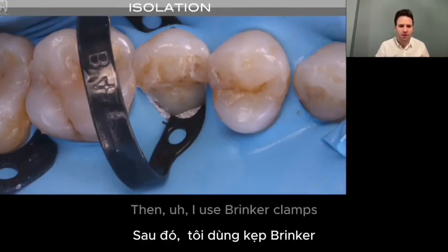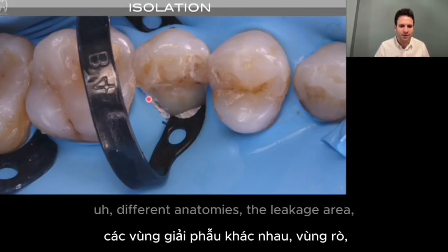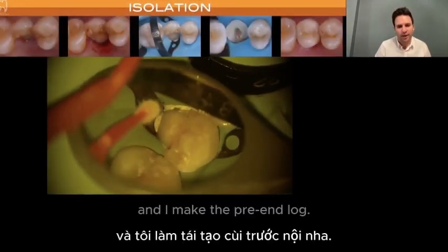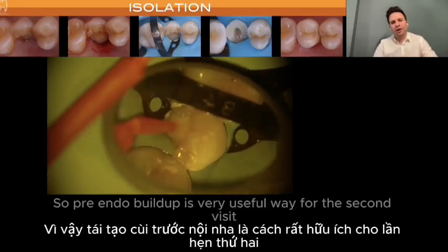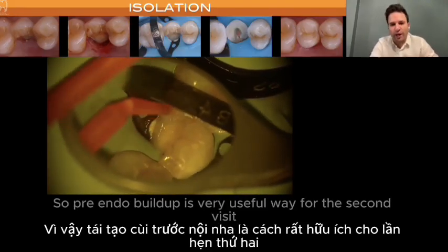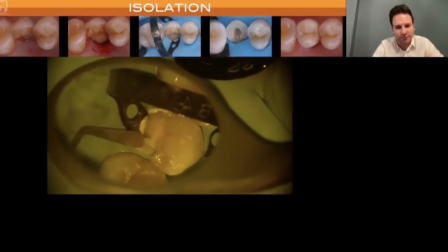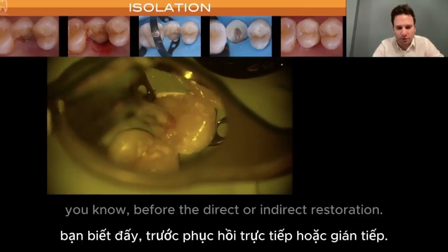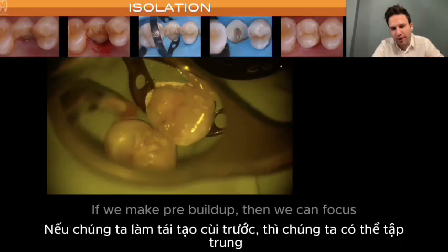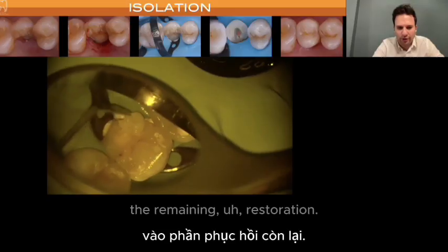Then I used Brinker clamps and Teflon tape here to isolate the different anatomies and the leakage area, and I made the pre-endo build-up. Pre-endo build-up is a very useful way for the second visit or second session. Before the direct or indirect restoration, if we make a pre-endo build-up, then we can focus on the remaining restoration.